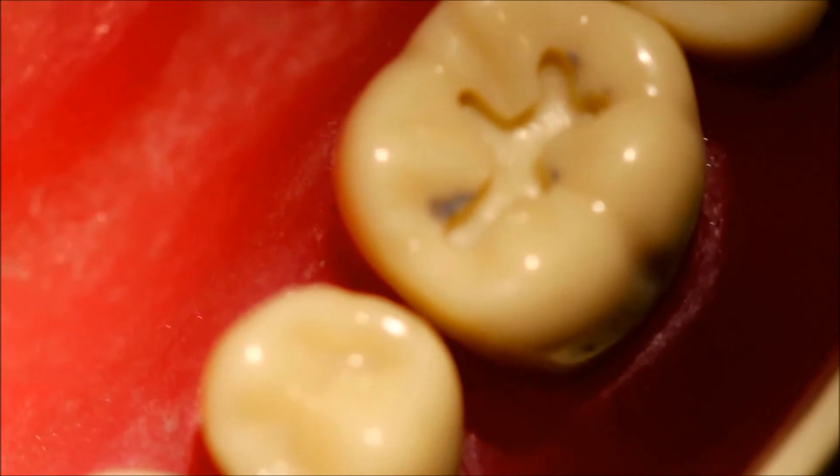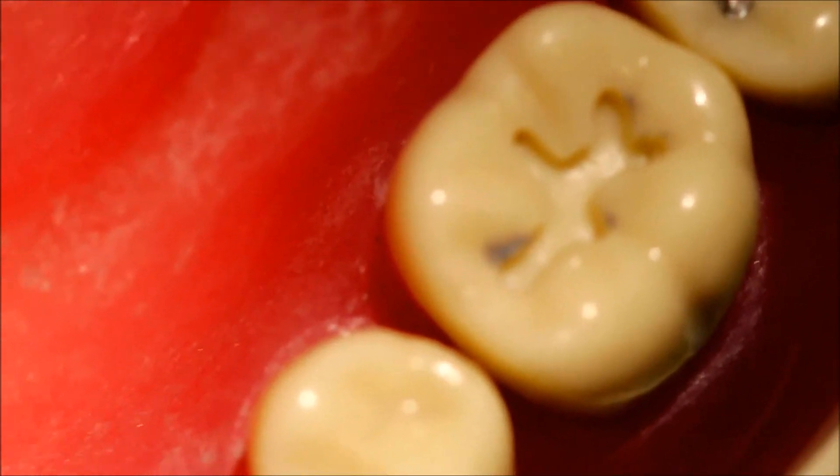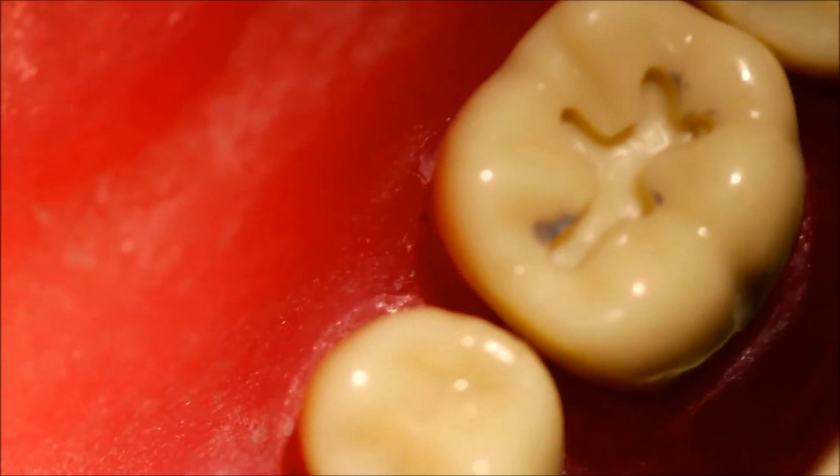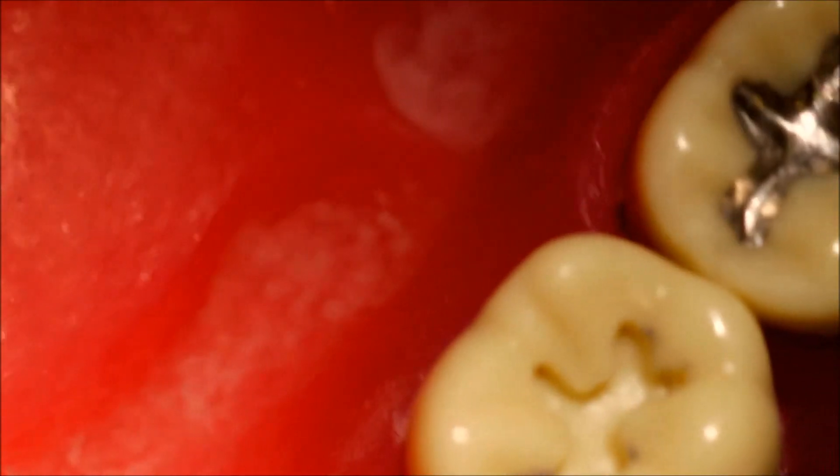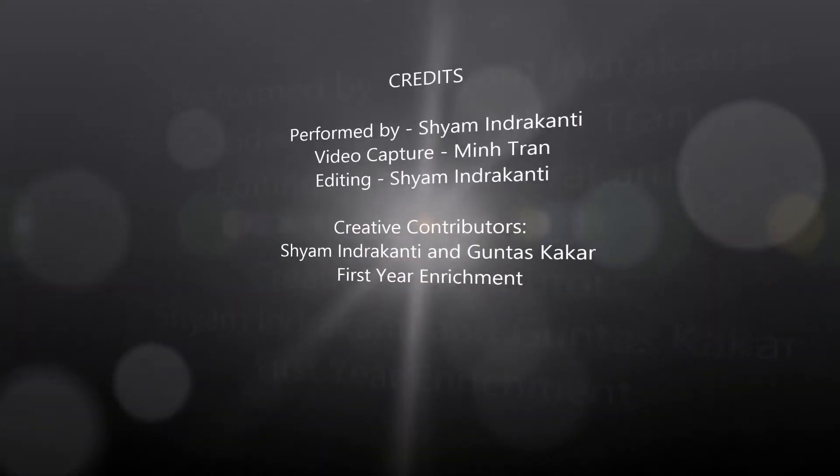And there you have it — most of the errors have now been fixed. The sharp corners are much rounder, and the isthmus is now much straighter.